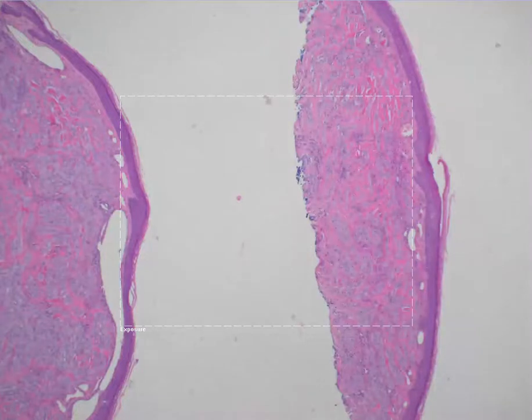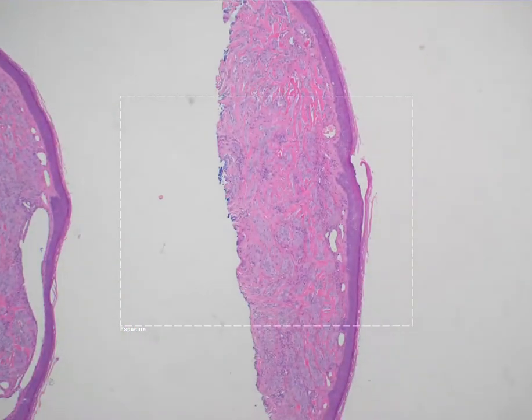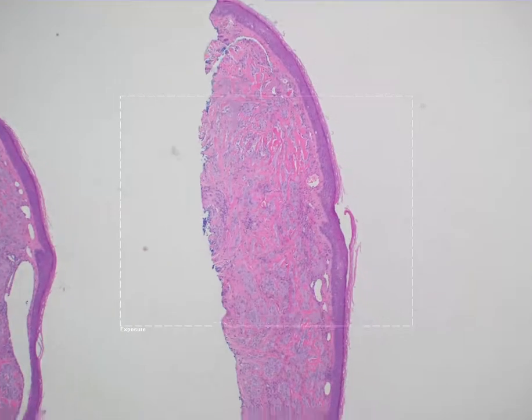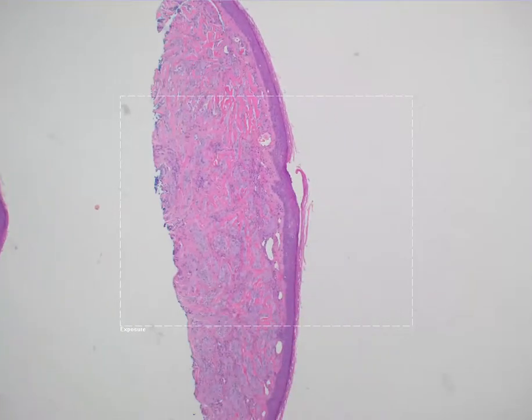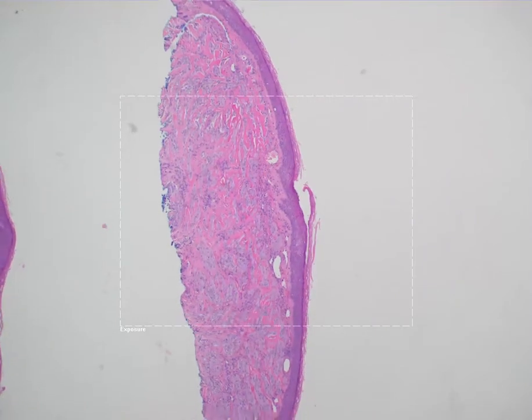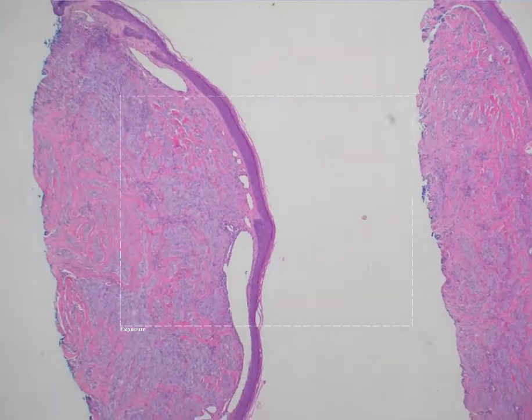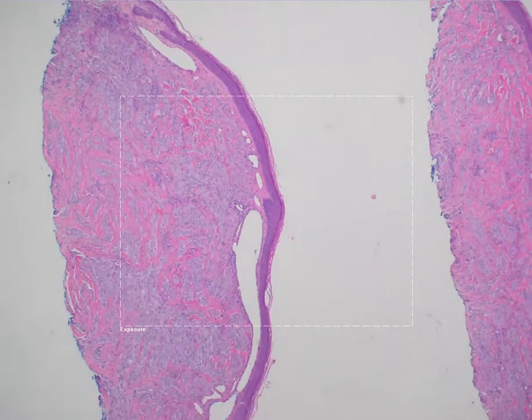Okay, the next entity that we'll be discussing is called a neurothekeoma, and this is the cellular variant of this entity. This is a curious entity in neural proliferations because the histogenesis of the cell is really unclear presently. And there's a broad spectrum of stromal changes that you can see that can make the histologic low-power appearance of this lesion quite variable.